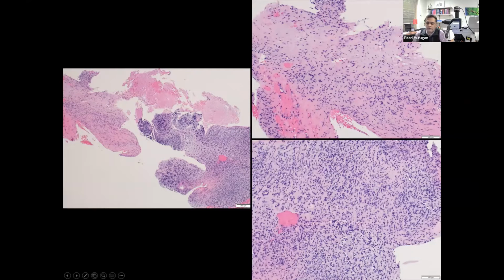So you see quite heavy cellularity here. There is a sheet of cells. Most of them look small and round, almost like lymphocytes, but there is also some pattern. There seem to be some tubular rosettes or some pseudo rosette-like structures. And the background here is also striking. It's different from what we see here. It is quite myxoid.